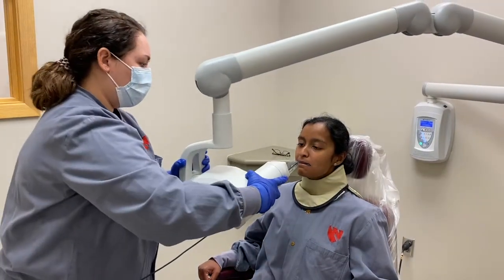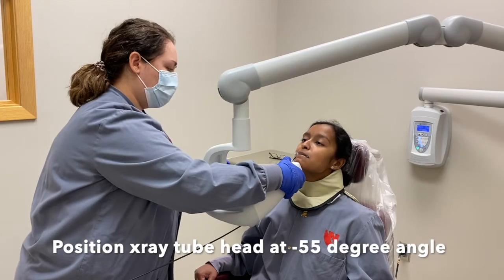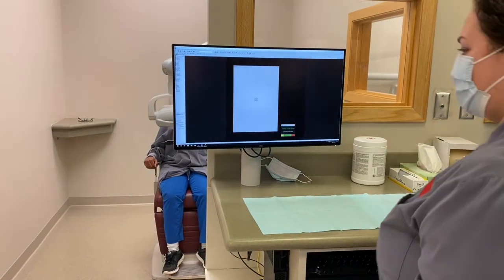Place the center of the machine under the patient's chin at a negative 55 degree angle and instruct the patient to sit still. Walk behind the wall and press the exposure button until the beep discontinues.